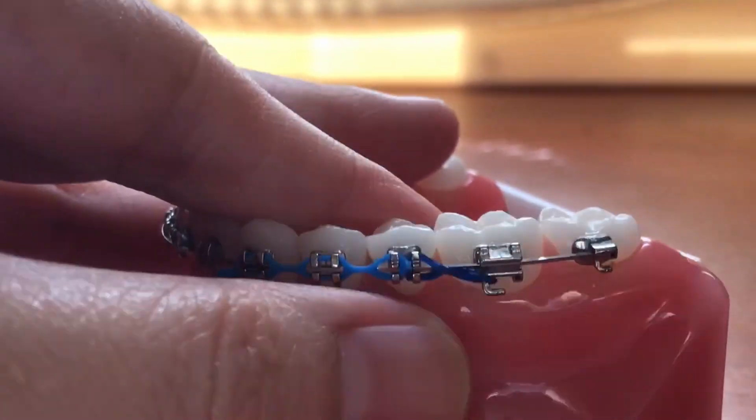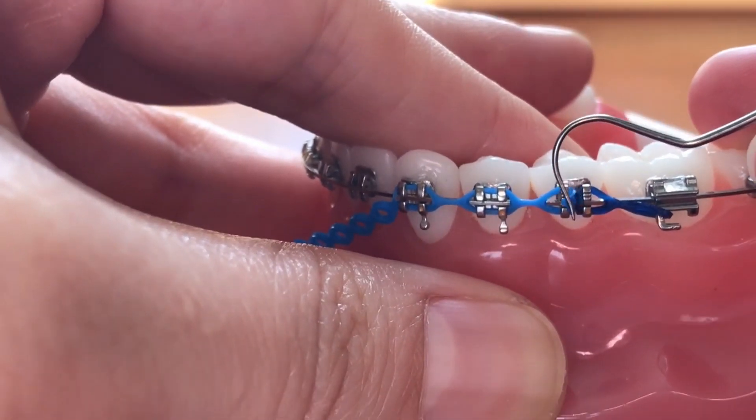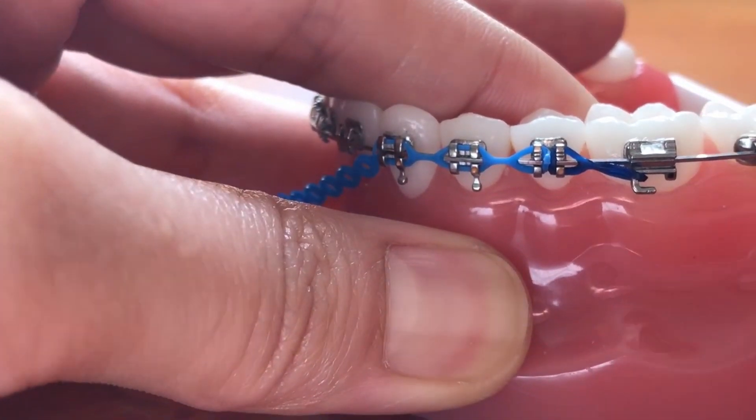We'll close in right here so you can see a little better. Now you basically have two separate power chains — one engaged on the front half of the bracket and the other engaged on the back half of the bracket.